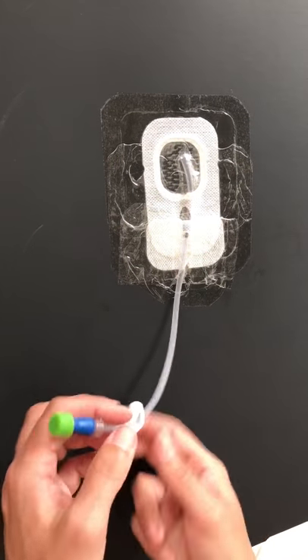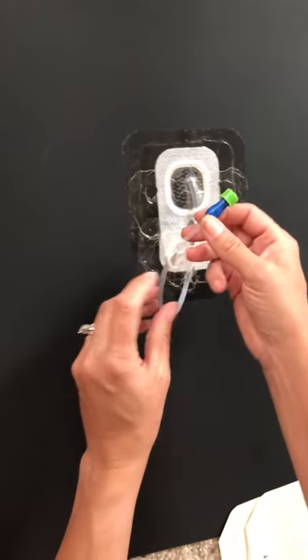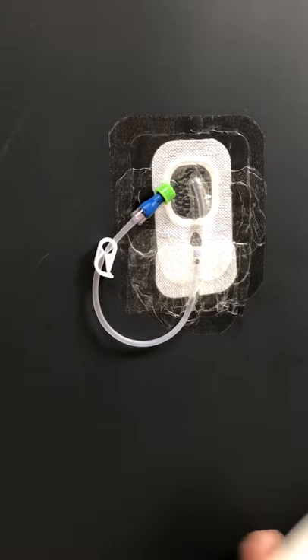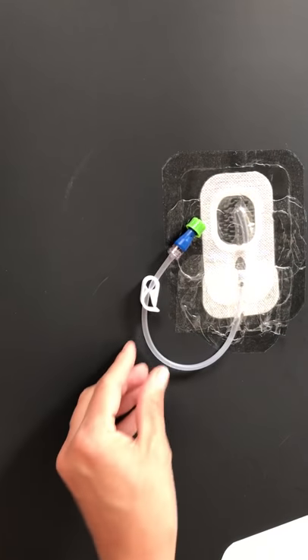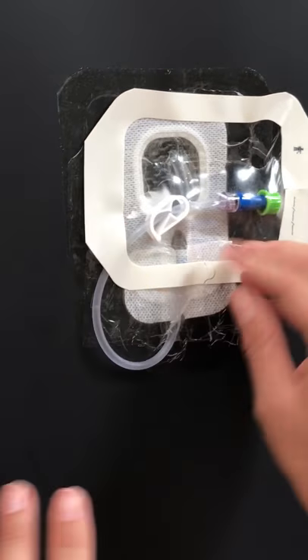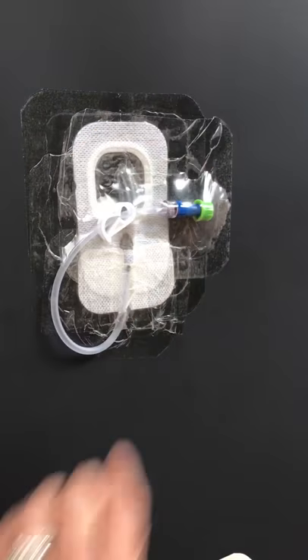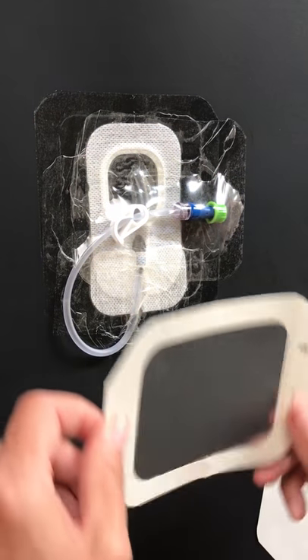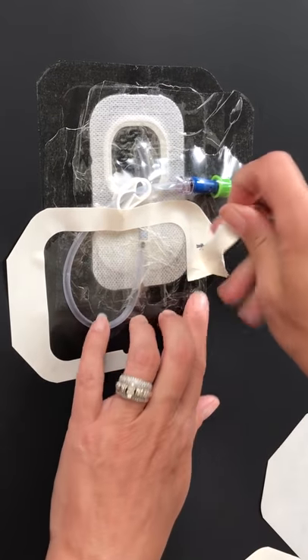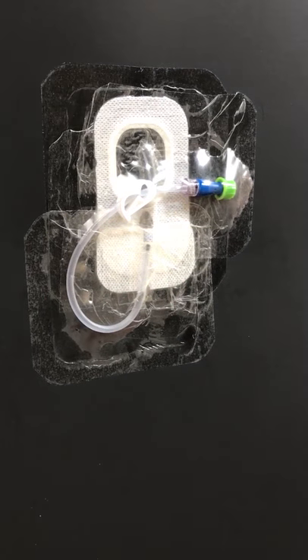To go swimming, you obviously have it clamped and have your green Kuro cap over the top. What I would do with his line is take it up over the top so that way it's folded up, and then here comes a bunch more Tegaderm. I would just start placing it over the top, making sure it's overlapping what you already have down from the original Tegaderm, and just keep going all the way around. It does take a lot. Making sure everything's done up and sealed up really, really well, going past what was already down for the weekly Tegaderm.